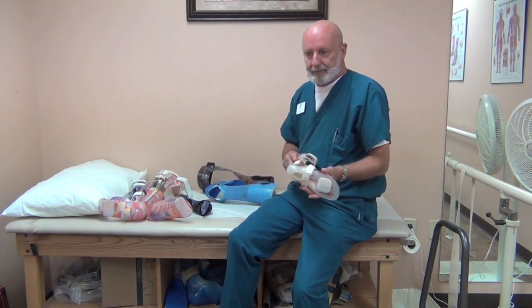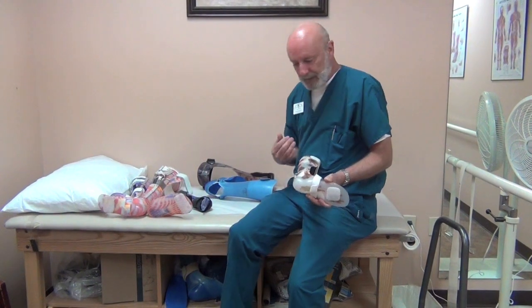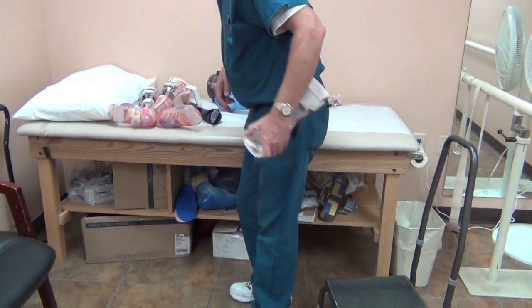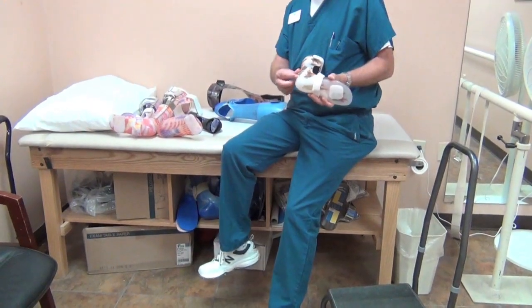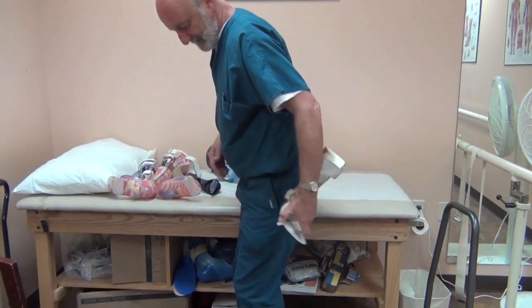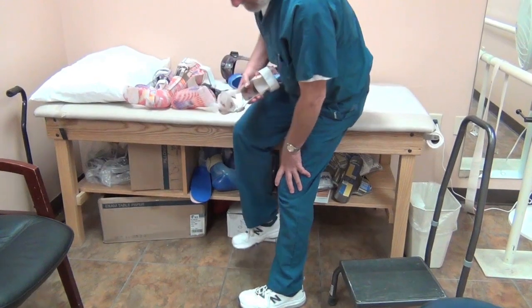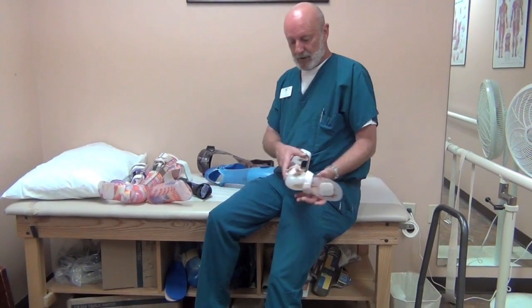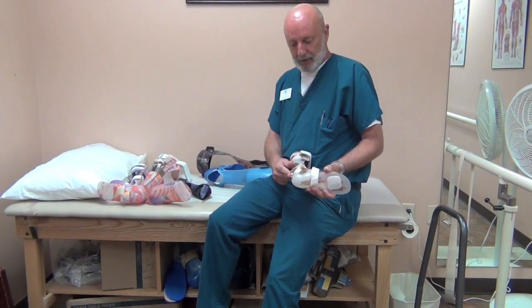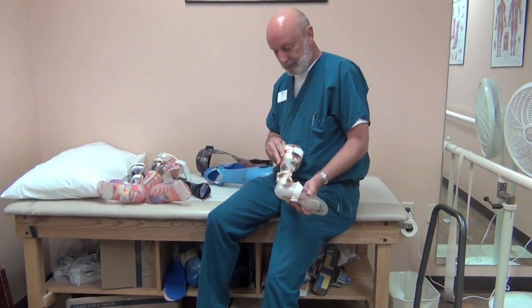If you have a tendency to lock the knee back into hyperextension when you walk, you might want to put a plantar flexion stop on there. This blocks the leg from going back too far to help protect the integrity at the knee so that you don't develop hyperextension over time — a bumper in the back to block the leg from going back too far.